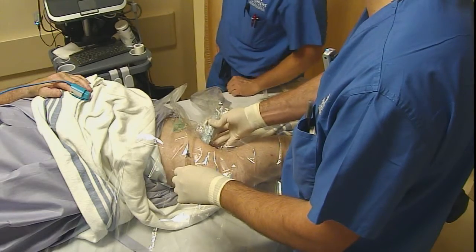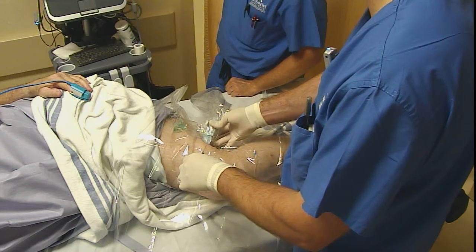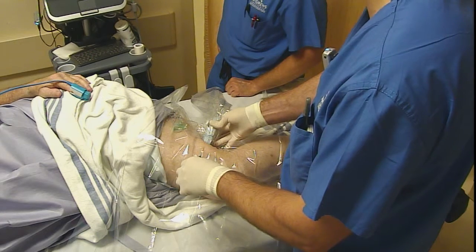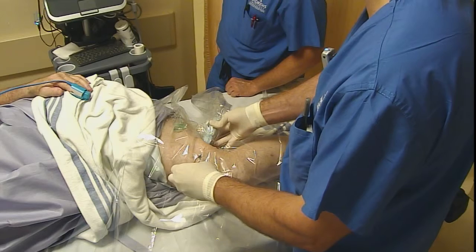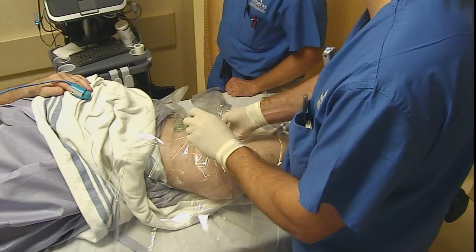This nerve is about 2.5 centimeters deep at this location. We'll draw an imaginary line from here out and go 2.5 centimeters deep to that for our insertion of our needle. Just using a perifix epidural catheter kit, off-label as a regional anesthesia kit.